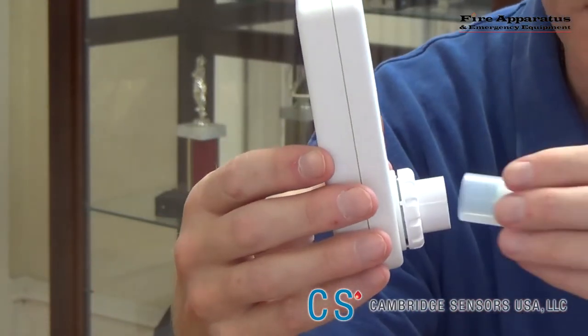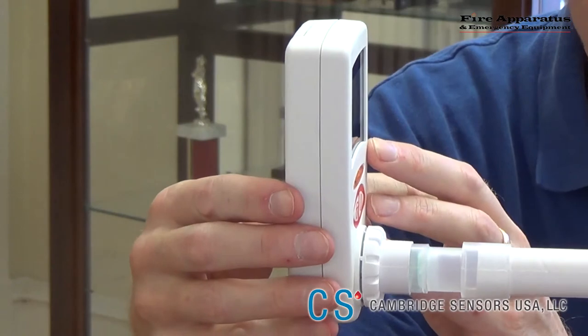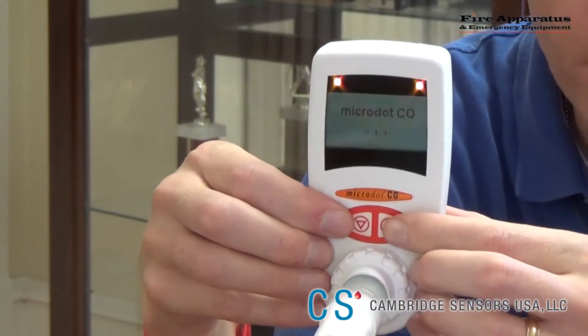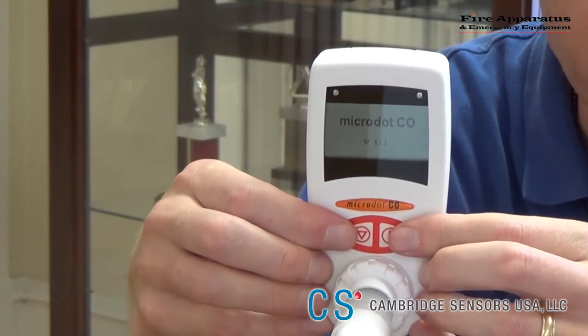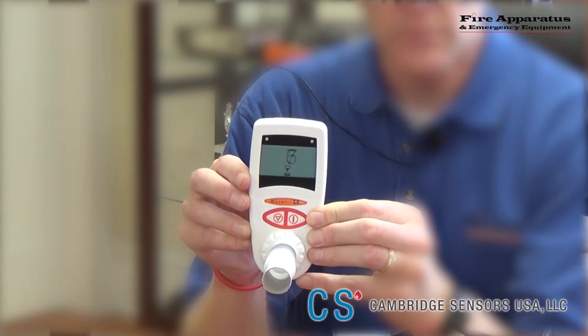To use, put the plastic adapter and the cardboard tube into the front port of the CO analyzer. Turn on the machine with the right button. When the countdown of 10 begins, that is when the patient should start holding his breath. The last part of the breath contains the most CO.